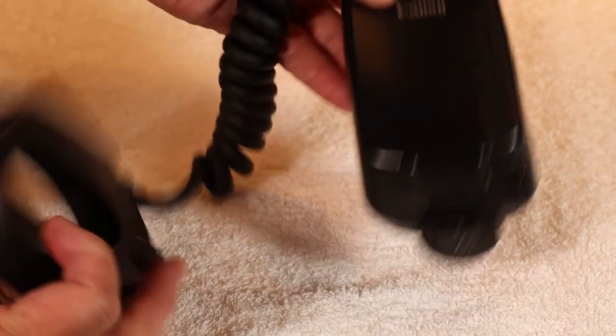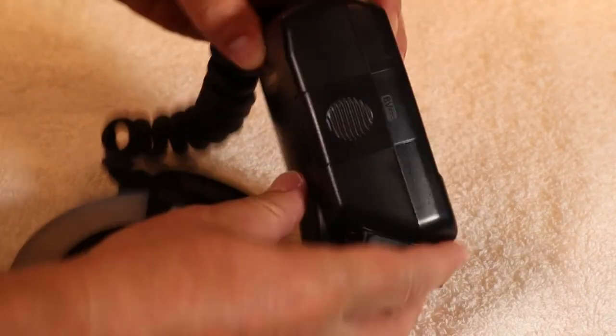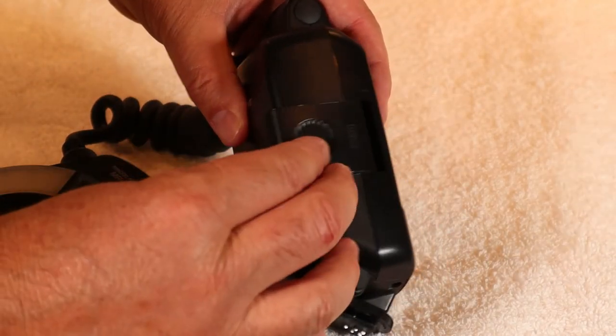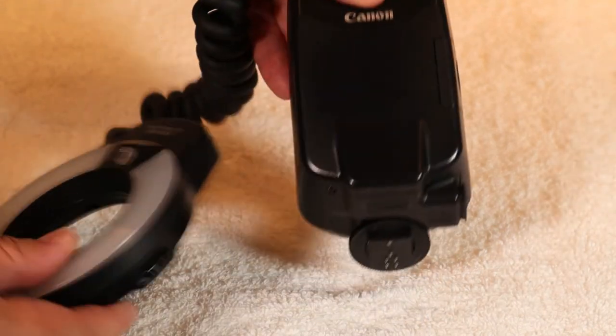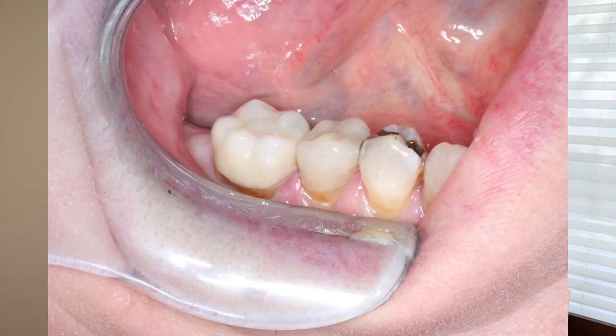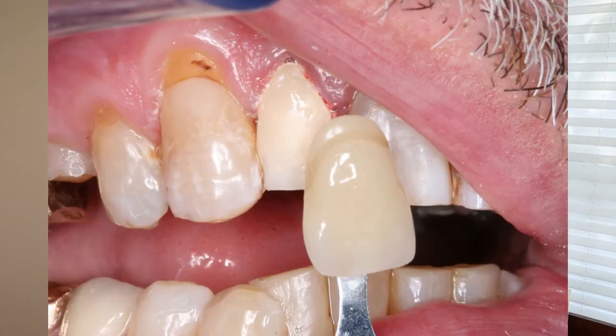The second piece of kit that I use to take macro photos is a good flash. I bought the Canon Macro MR14 EX Ring Flash. It runs off of four AA batteries. The control box mounts on the hot shoe of the camera body and the flash itself mounts onto the end of the macro lens. The ring flash is needed to minimize shadows because the mouth is a pretty dark place. Here are some photos I've taken with this setup.